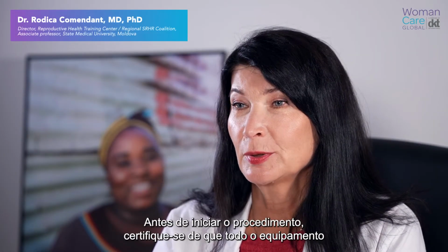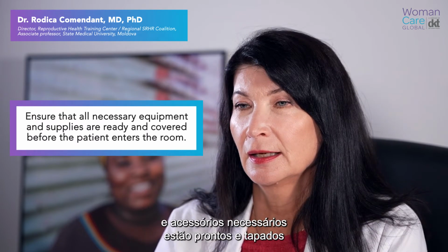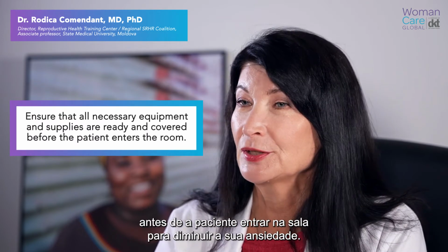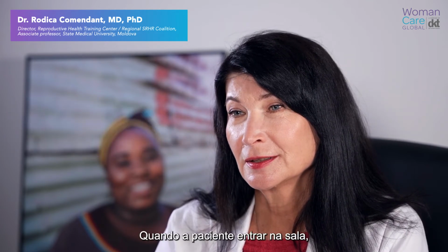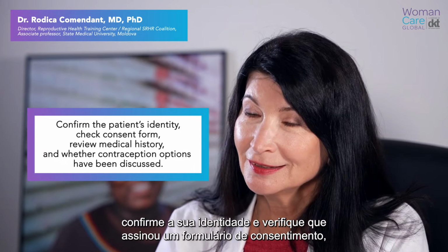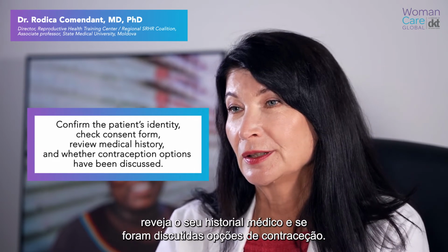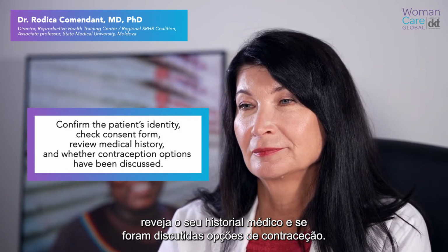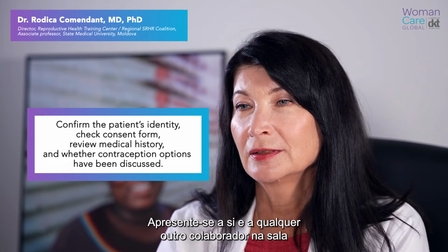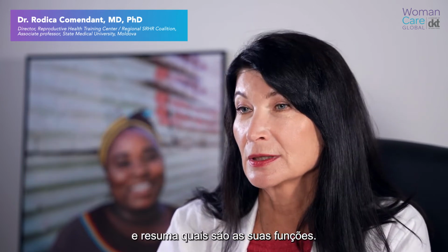Before starting the procedure, ensure that all necessary equipment and supplies are ready and covered before the patient enters the room to reduce anxiety. When the patient enters the room, confirm her identity and check whether a consent form has been signed, review her medical history, and whether contraception options have been discussed.